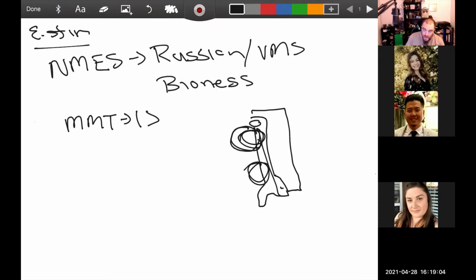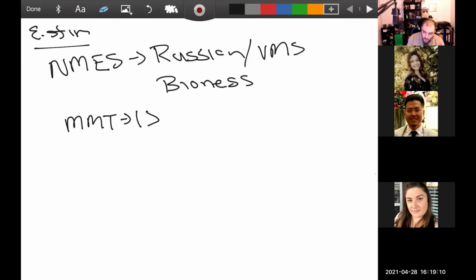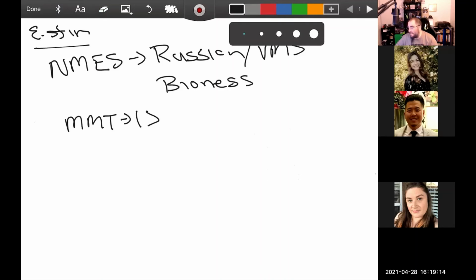And for patients, honestly, I'm going to be 100% honest, it's a trial and error thing. I've had some, even students, where I try to get their tibialis anterior to fire, and I can't get past that eversion because their legs are tiny. And no matter what I do, I have to go down to little itsy bitsy 1-inch pads, and then I can get full dorsiflexion. Because the muscles are so small, not small as in, not small for their size.